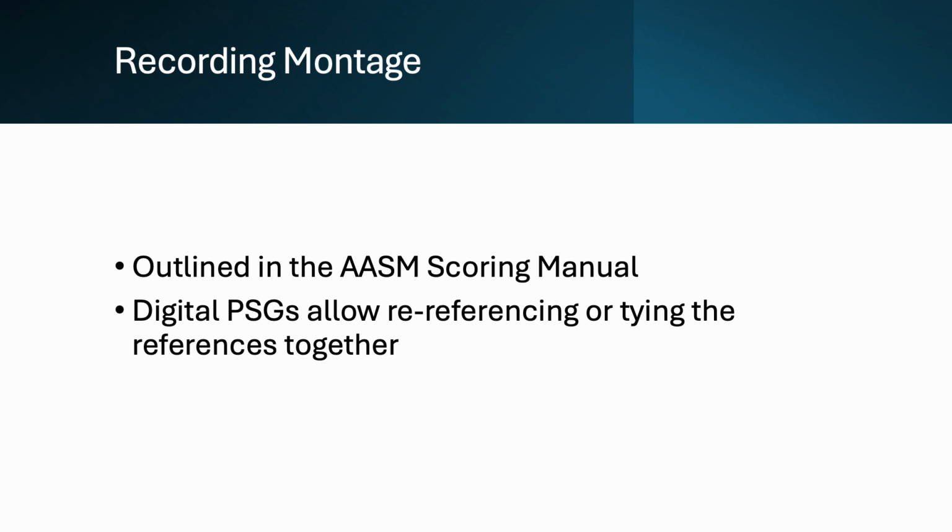This used to be called linked ears because you could put something called jumper cables on the mastoid references, and that would link them together to attenuate the EKG artifact. Many recording variables in different montages can be used in order to satisfy the requirements of the ordering physician and aid in diagnosis.